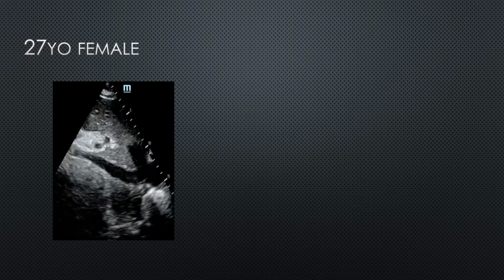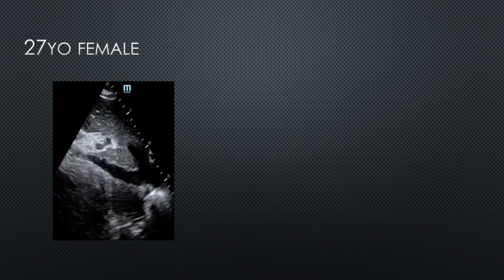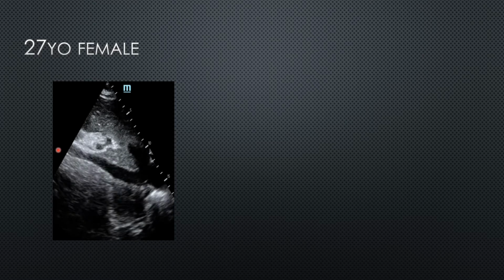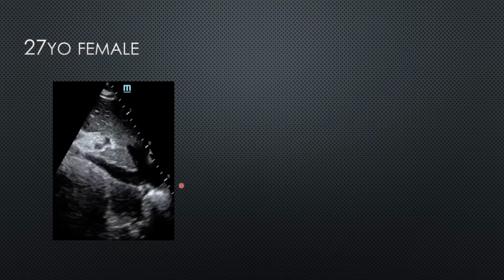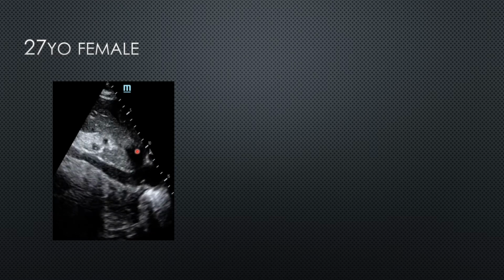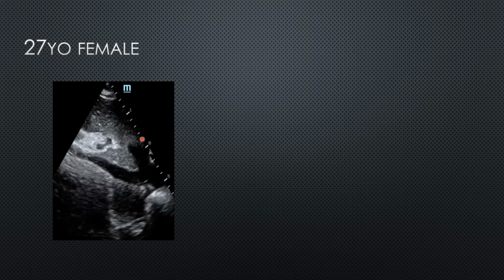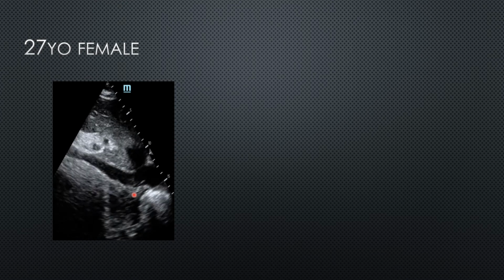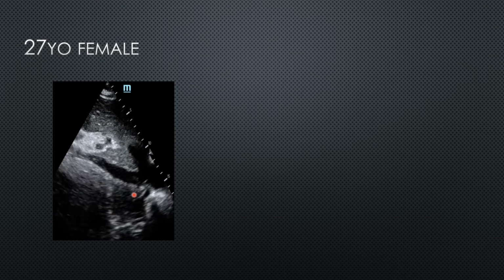So it's now 4 a.m. and he comes to you again for advice. This time he's seen a young 27-year-old female with no past history who's presented with the same thing, shortness of breath, hypoxia, tachypnea. This time he's got an IVC view. So this is the inferior vena cava here, draining into the right atrium. These are the hepatic veins here, which are quite engorged. So I think you'll agree that IVC is quite distended and there's minimal collapsibility, so you could call this a plethoric IVC.